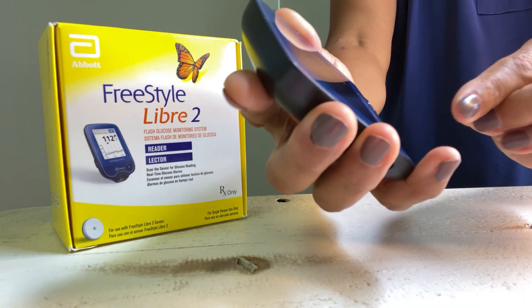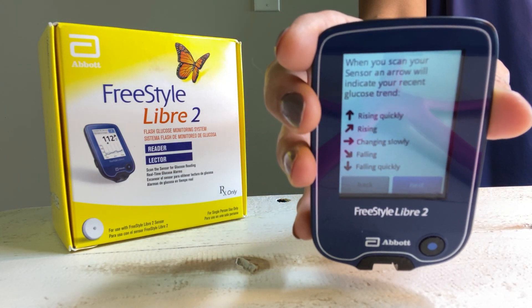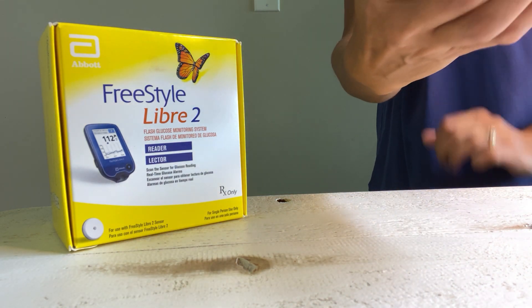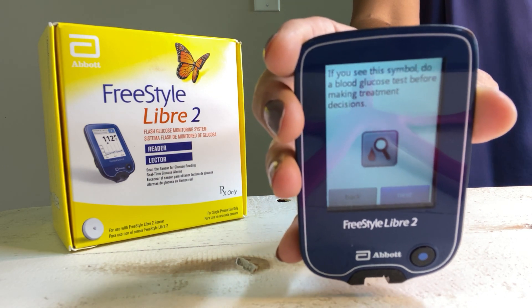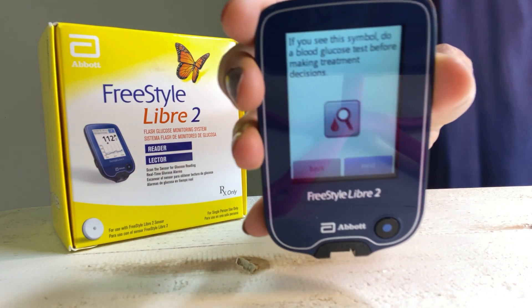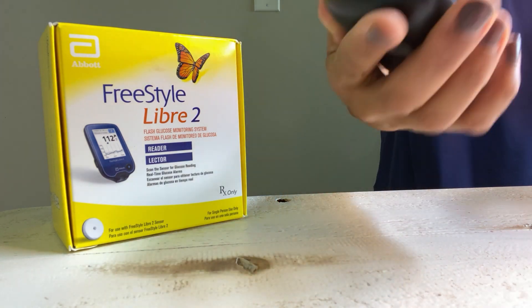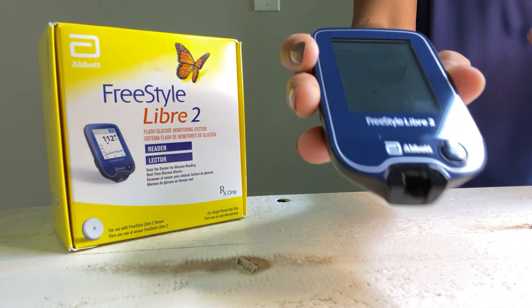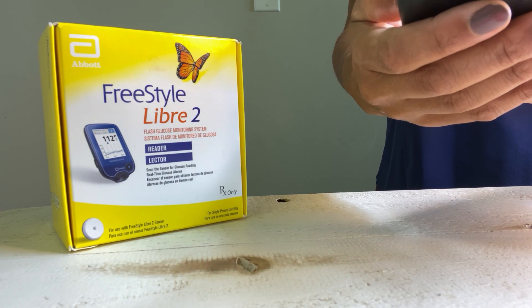It then gives you an explanation of what the arrows mean — how quickly things are changing. It explains that if you see a blood drop and magnifying glass icon, it means you need to verify readings with a blood sugar measurement using a finger prick. It also tells you that it functions as a meter, though I don't have test strips for it.